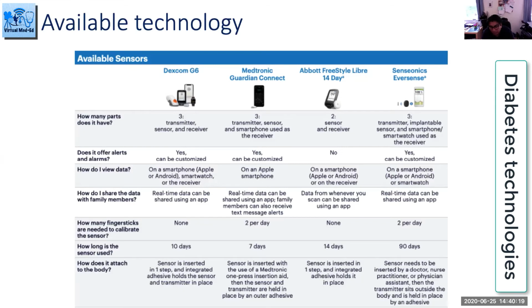And don't forget, when we talk about CGM, you've got the real time where the information is being relayed in real time to a receiver, be it a phone or a reader, but also there's alerts coming through if it's appropriately set. And then the other form of so-called CGM is your flash glucose monitoring, which is your Freestyle Libre, which we are very, very familiar with. And there are some unique selling points. For example, Dexcom doesn't need calibration. You take it at face value, and Dexcom has a license for it to be used for carb counting. You don't need to check your capillary glucose.